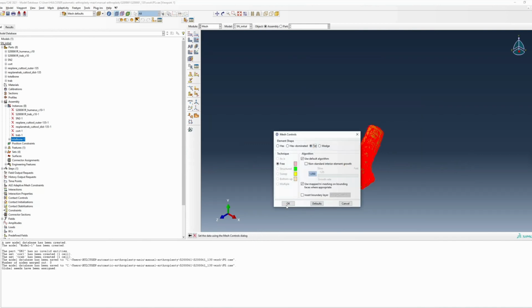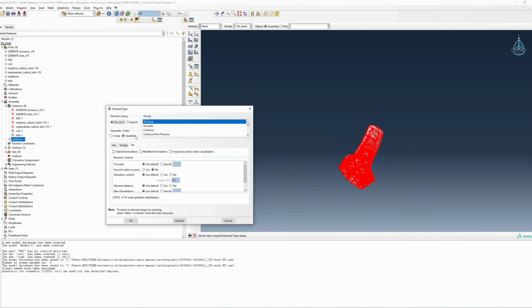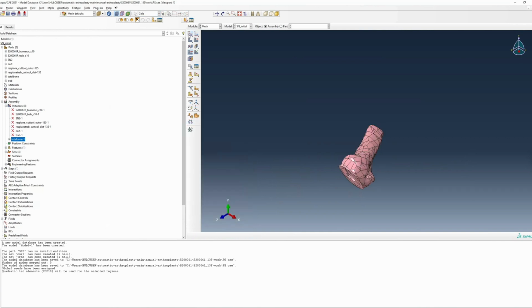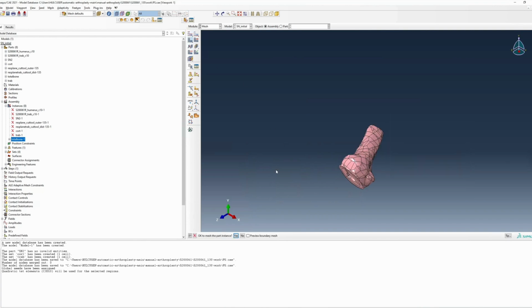For my finite element analysis, I would like to use solid tetrahedral elements. So here you can see me assigning C3D10 quadratic tetrahedral elements to my model. Sometimes this process can be a little finicky. If you run into issues, the first thing you should do is assign your mesh controls as well as your element type, then reseed your part, and most errors should go away.